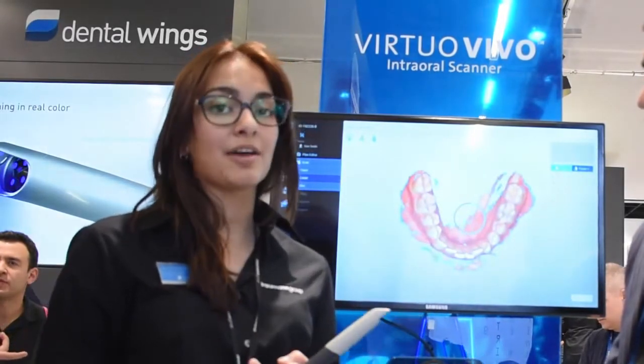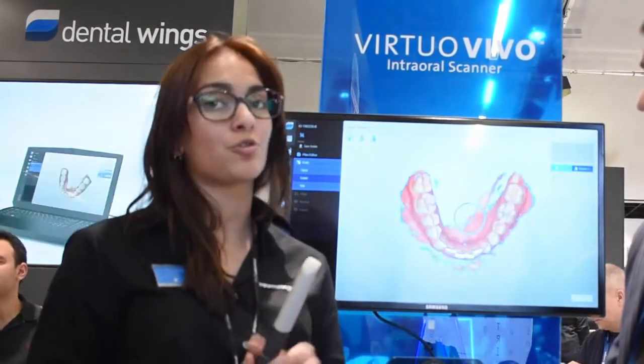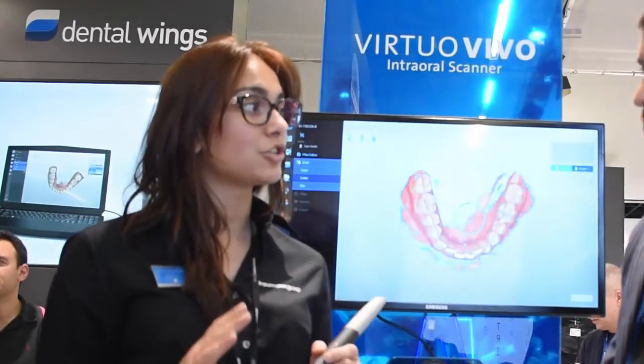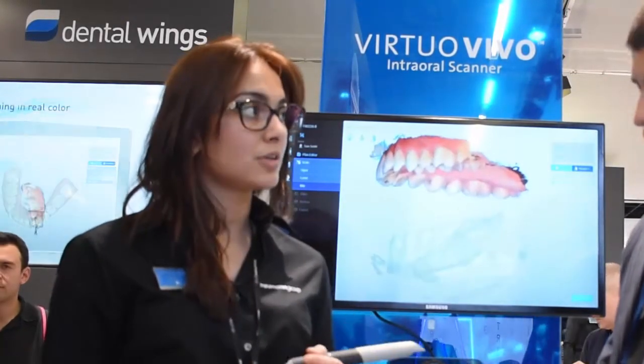We're an open system. We can export STL and PLY files. At the same time, we're fully integrated with the ClearCorrect clear aligner orthodontic workflow. So for the user, the individual has nothing to do — it's all automatic and the files are sent directly to their ClearCorrect address.